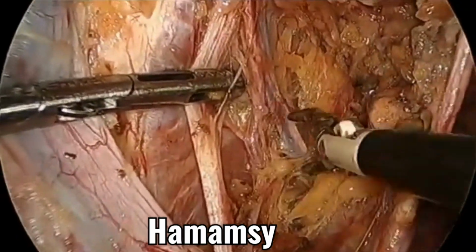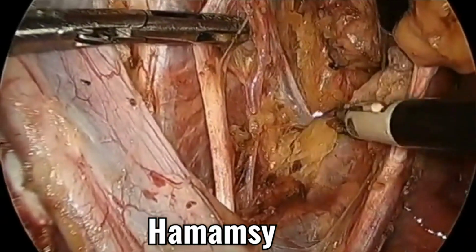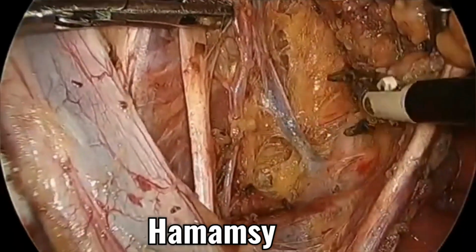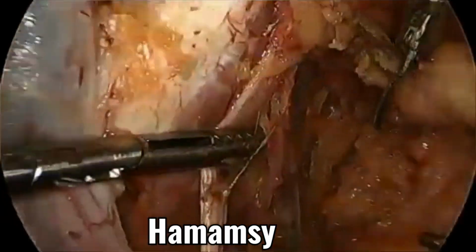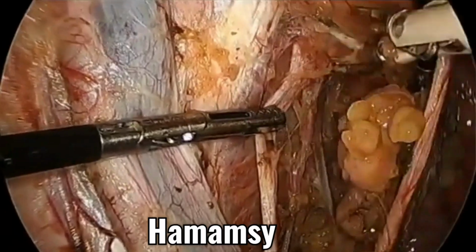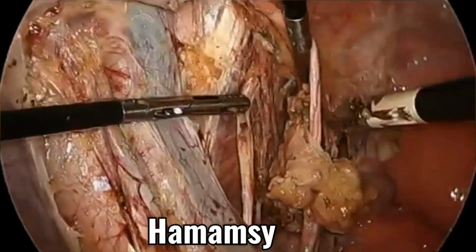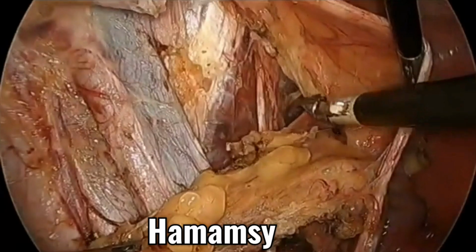Very important, the closures: to deflate the abdomen and remove the trocar under vision. Then fascial closure, very important. Any 10 millimeter trocar must be closed by fascial closure. Okay, very important to prevent any port hernia. Retrieval of the lymph node in the endobag and extracted via the port site in the endobag.